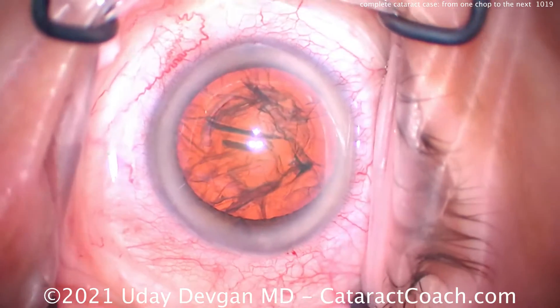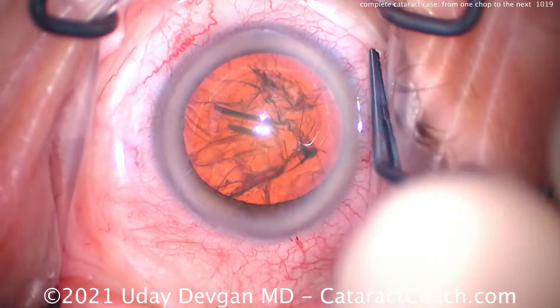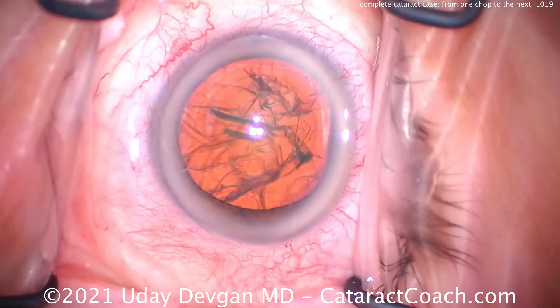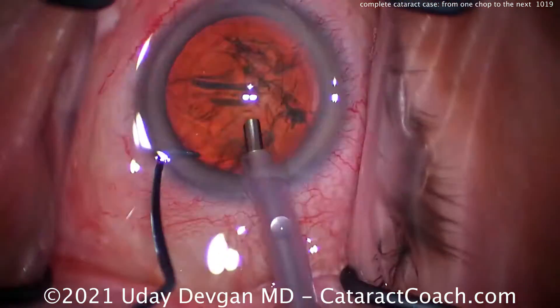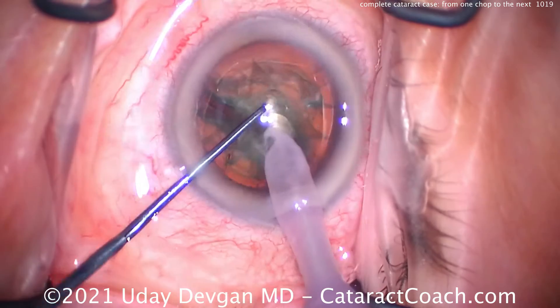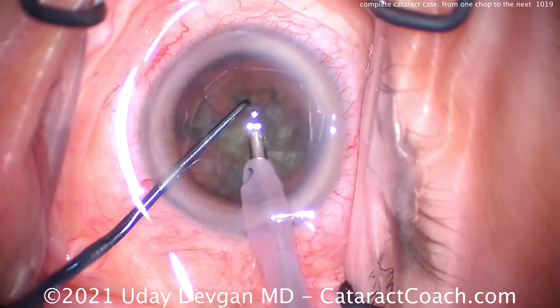Here comes the part you're waiting for. There's the viscoelastic — here comes the phacoprobe. As soon as we chop it and split that nucleus into two halves, what we're going to do is proceed to the next chop. Phacoprobe going in here, let me adjust that sleeve a little bit — bevel down is my technique. Take the chopper in there, buzz in with the probe, pass the chopper. Here comes the first chop — two halves are achieved. Now immediately buzz in again and chop again. Now you've got a quadrant that's been made. Rotate it, then buzz and chop. That's the method we're going to do here.